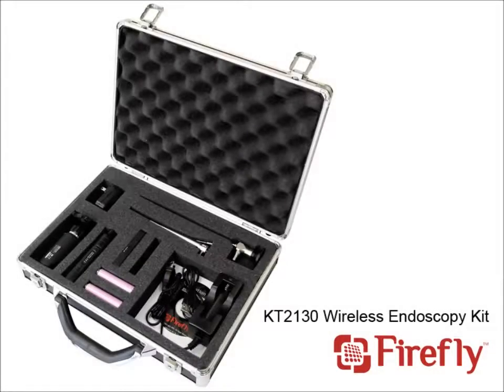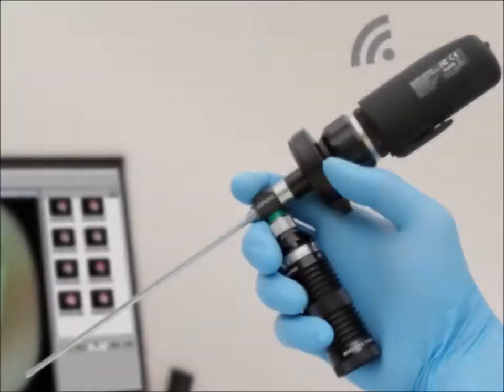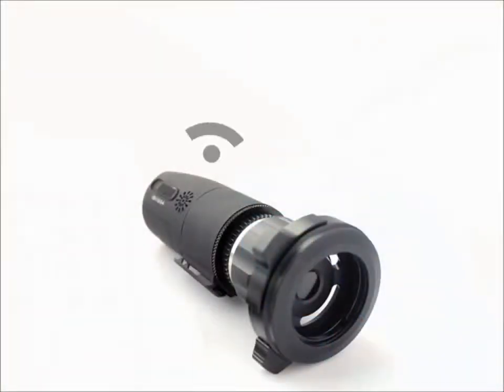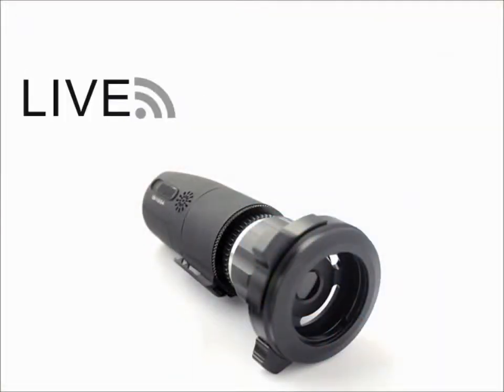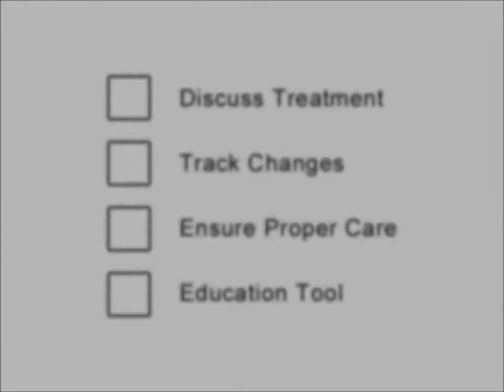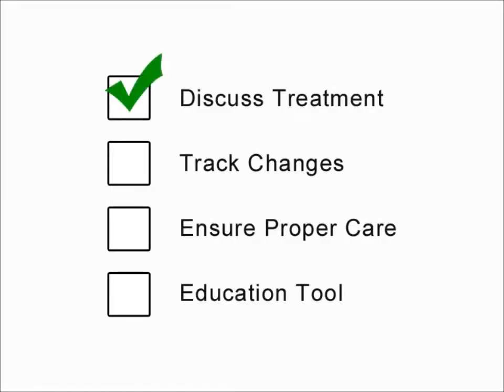The Firefly Wireless Endoscope Camera is a revolutionary device that helps medical professionals improve patient education and communication. With the ability to wirelessly transmit a live feed, send pictures, and record video to a computer, a medical professional has the means to discuss treatment with a patient.